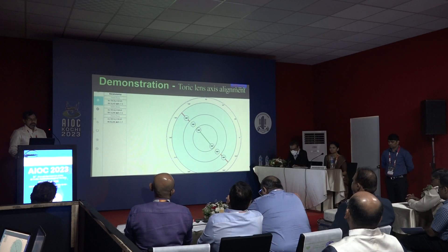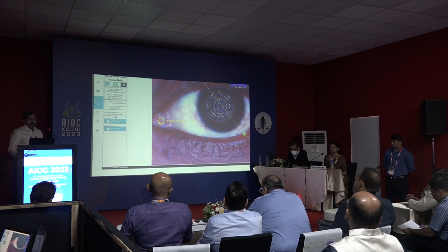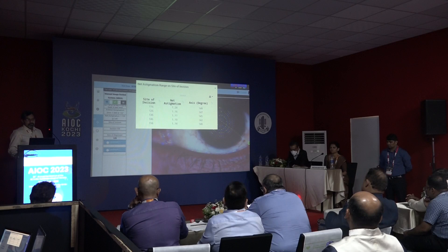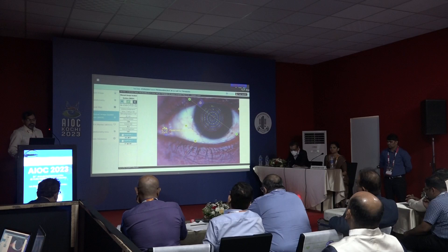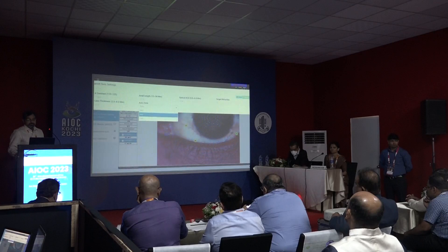Demonstration of toric lens axis alignment. Left-eye keratometry of this patient shows 1.5 diopter astigmatism at 132 degrees in the 3mm zone. Press the calculator icon — net astigmatism is displayed directly from the Barrett Toric Calculator: 1.1 diopter at 145 degrees in this case. Enter SIA value of 0.3. The axis of alignment is displayed automatically at 147 degrees.